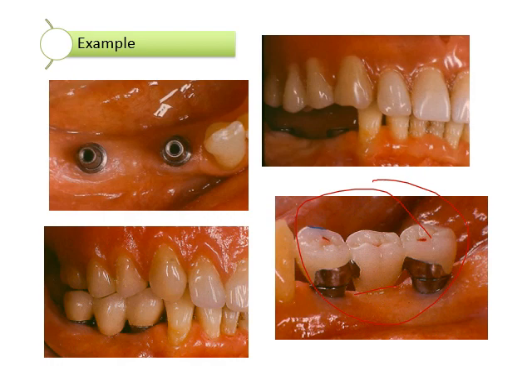And that's where you would want to focus on cleaning as well. When you're treating patients like this, we're going to talk about how to clean an implant shortly. But just know that that is your Pontic with a fixed crown bridge.